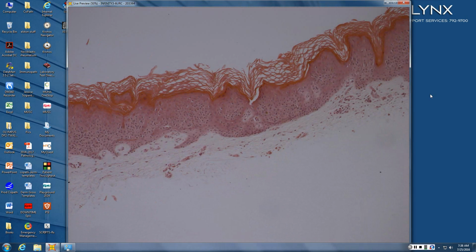This looks like another seborrheic keratosis. Why is that epithelium different from this epithelium? It looks like it might be more of a clonal seborrheic keratosis. Yeah, clonal seb. So the cells of a seborrheic keratosis are small keratinocytes.